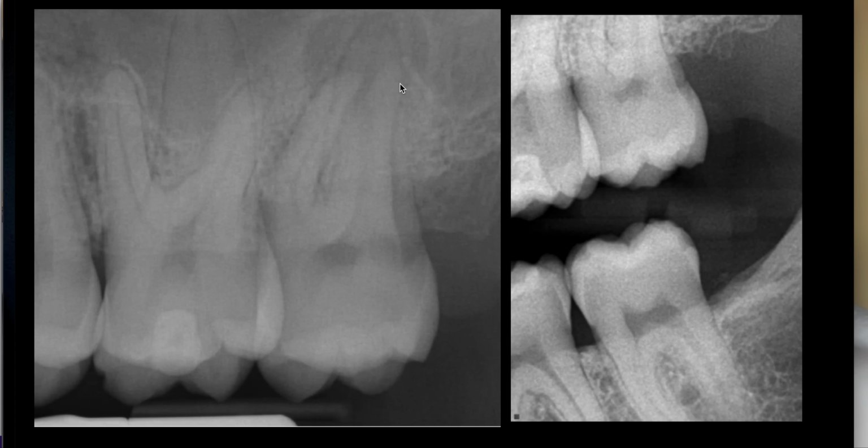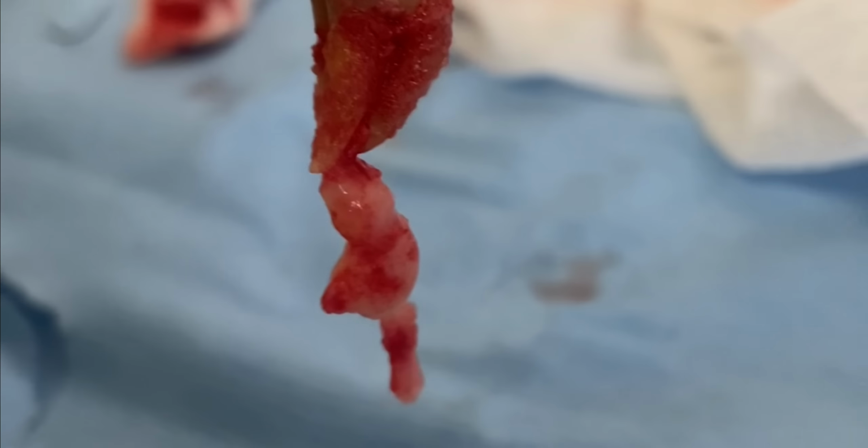So before we get into this, let's take a look at some radiographs. This case is not the exact case, but one I posted a little bit ago, and it's a bit of housekeeping, if you may. We're going to talk about the biopsy report. This tooth I deemed non-restorable. This lesion was right at the gingival margin, and we had this large lesion. It was necrotic. That is a huge lesion.